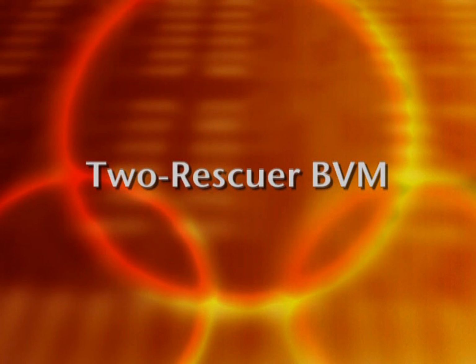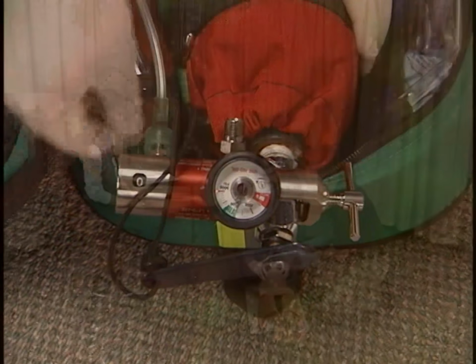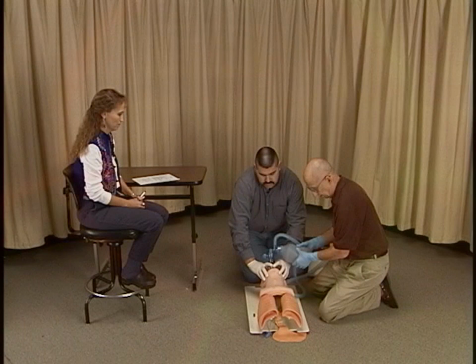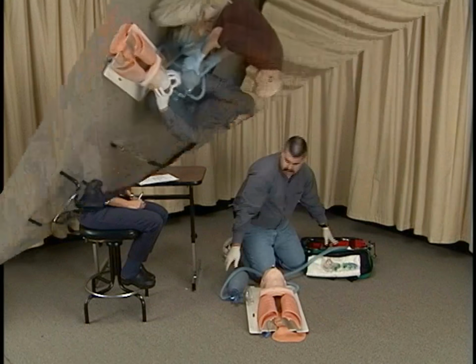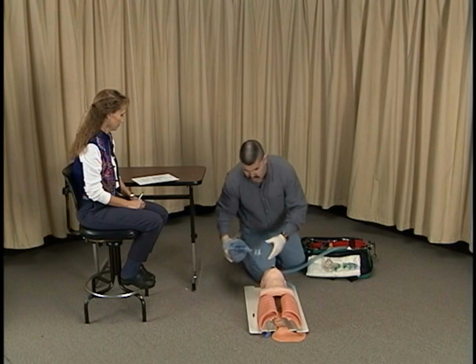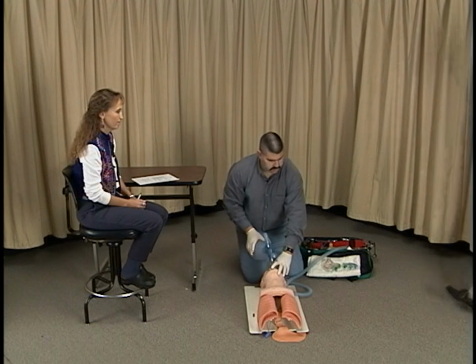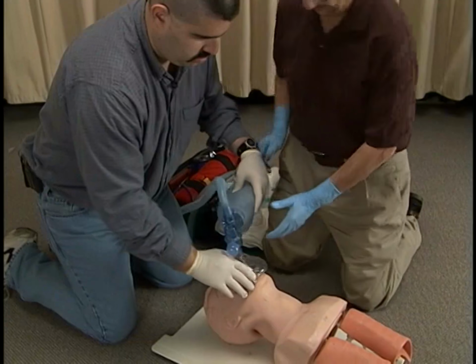Once the initial ventilations have been provided and the BVM attached to supplemental oxygen, a second rescuer will become available to ventilate the mannequin using a 2 rescuer BVM technique. Resume ventilations at the proper volume and rate. Here's a second EMT to assist you. Hey, John, let me give you a hand there.